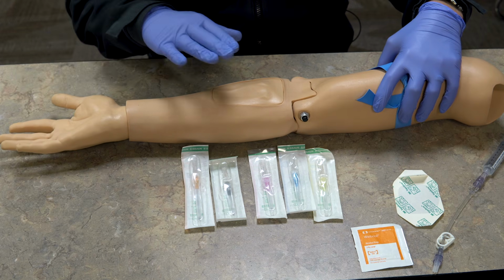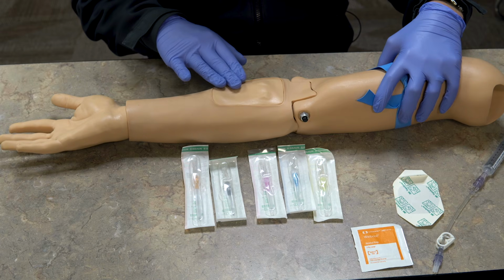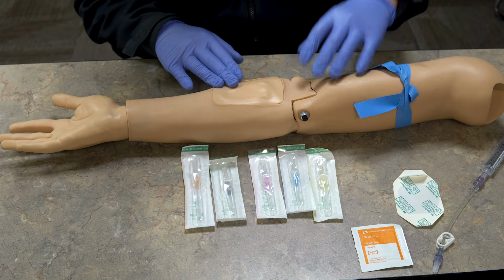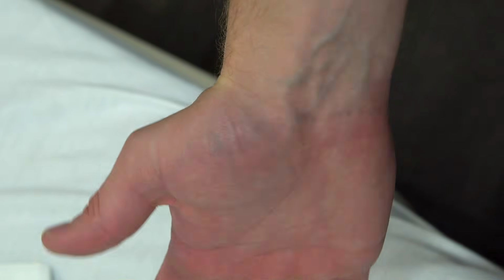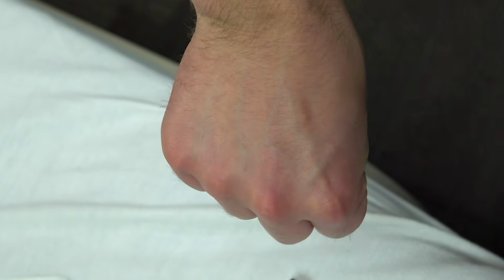So for this demonstration, I'm going to be doing it here because this is where the veins are in this simulated arm. And what you're looking for is, sometimes you can see them and you'll have like a blue discoloration on the vein. I'll cut to some footage of people's veins so you can see them. I'm sure you know what they look like.